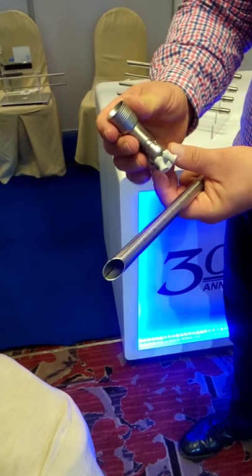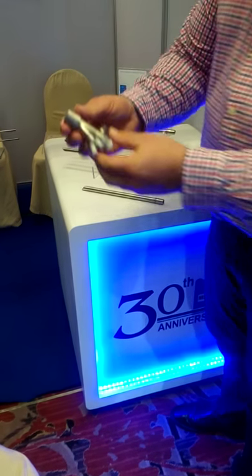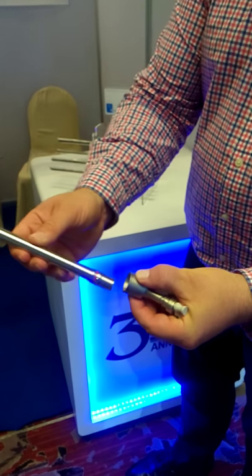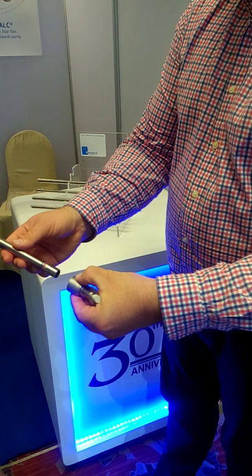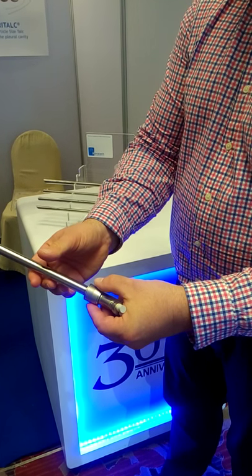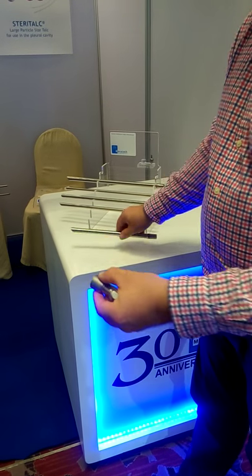The interesting thing is there is a spring here with which you can assemble the tubes. At each and every position, you just pull back the spring and then insert the tube, and then it fits. To release the tube, you do the same — you pull back, and then you have it out.